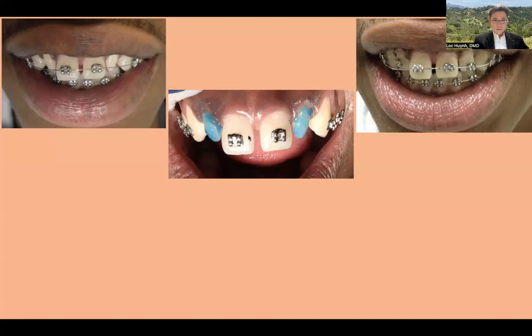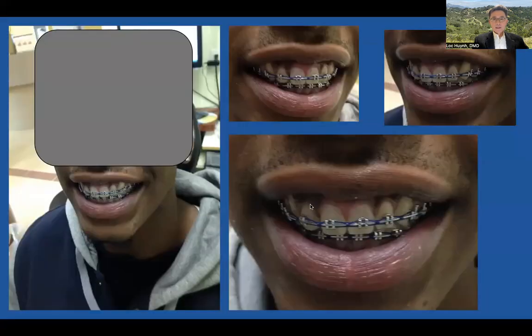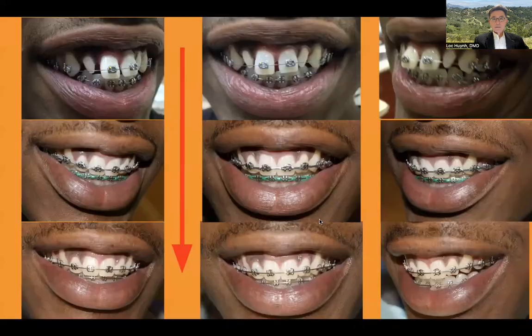So I did lateral veneers on both sides for him. And you can see that I created a reasonable amount of size and space for these particular peg laterals. So I gave him something. Then I started moving the teeth and closing the gap. As months go by, you can see the improvement right away. So here we go: beginning, starting, ending up with composite veneers and then closing the gap. Great improvement, and the deep bite is solved. From here to here, big difference.